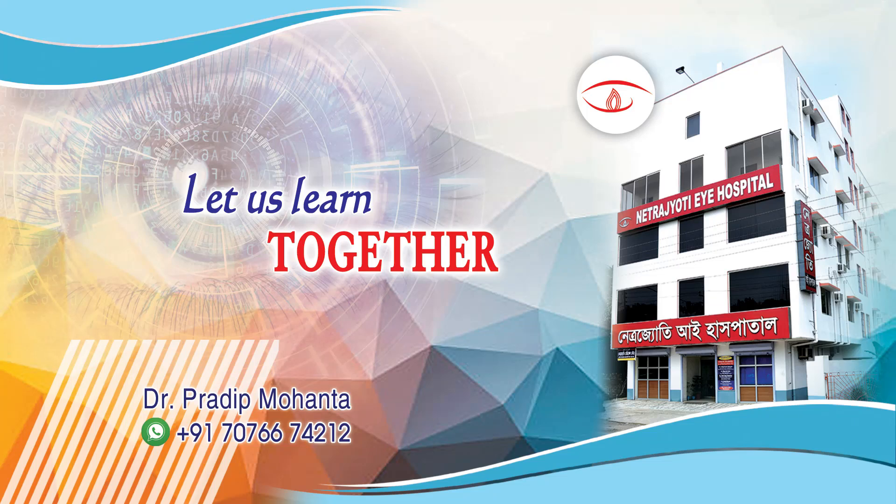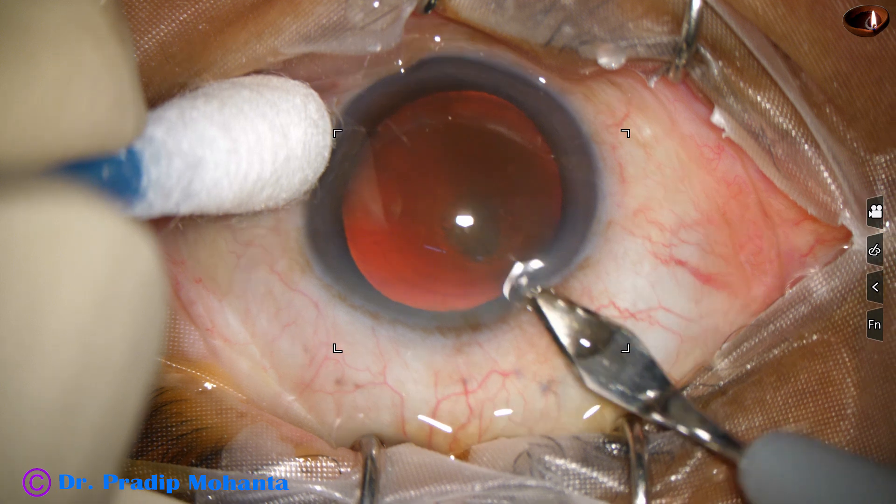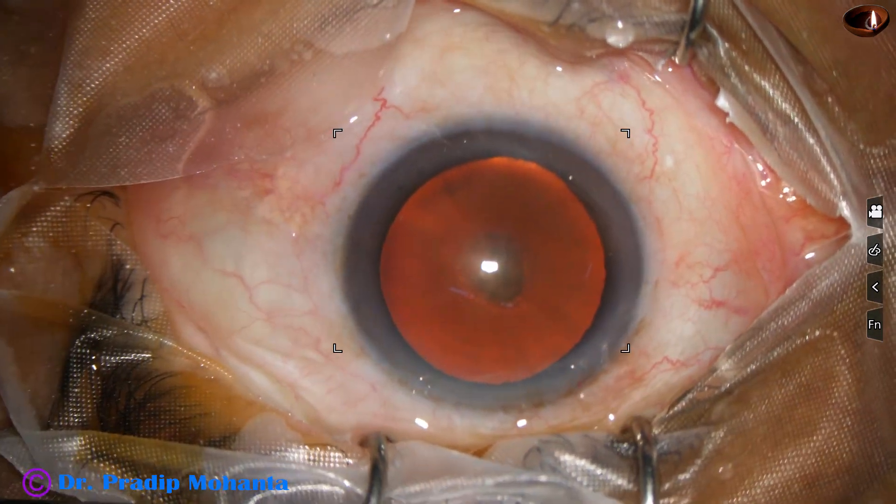Friends, welcome to my workplace for hands-on phaco and SICS training. This is actually a hard cataract, but because of the red glow, it is appearing not so hard. Let us observe this surgery.